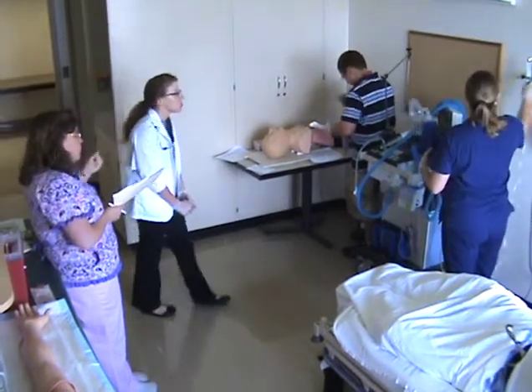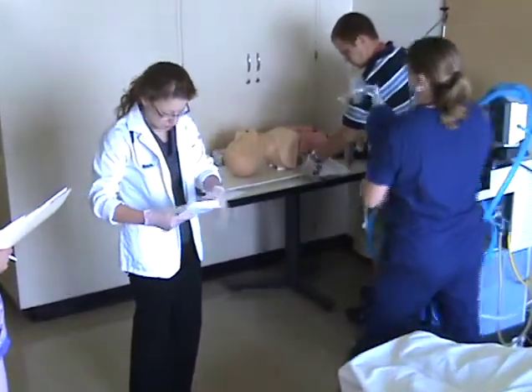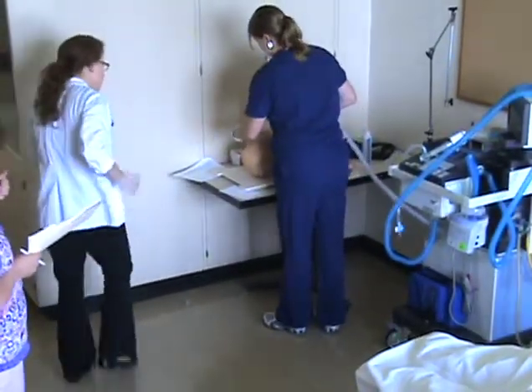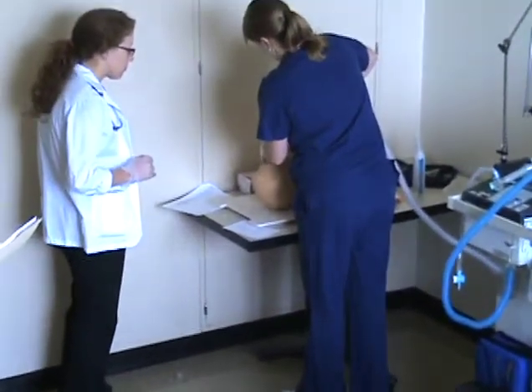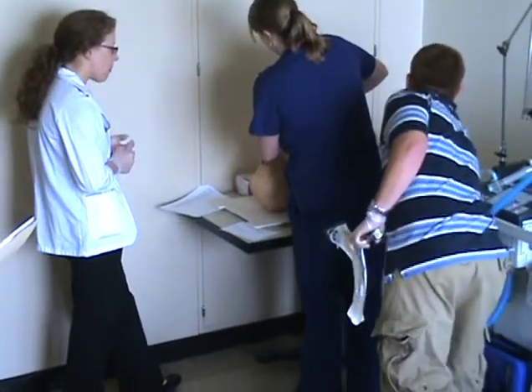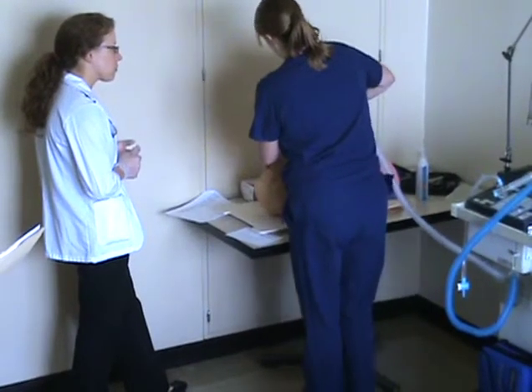Everything should be hooked up to the O2 valve. Bagging wise, you want to make sure that this is placed directly over the nose and that there's a good seal. Then you're going to bag breaths and look for chest rise and fall.